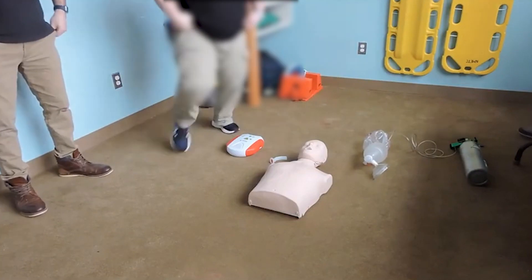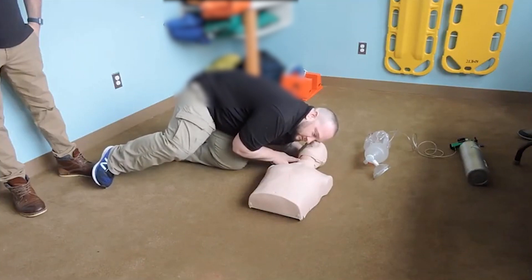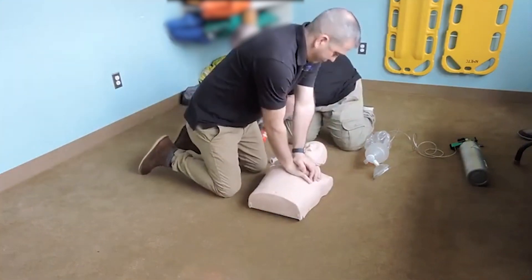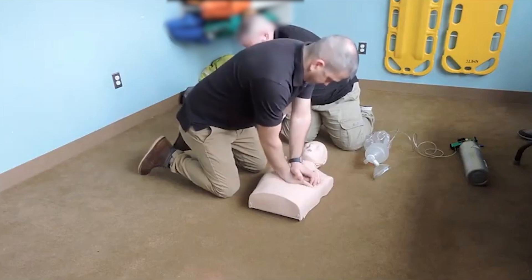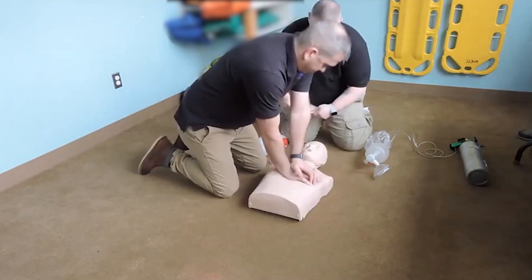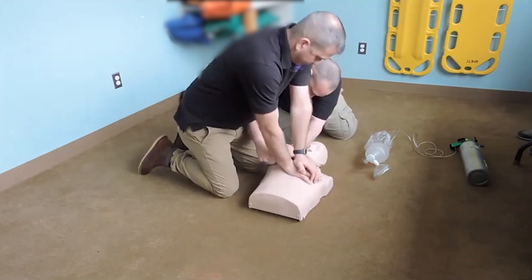On scene. Scene safety, BSI. Finding the patient. Sir, sir, can you hear me? No response. I'm checking for a pulse and I'm checking for breathing. There is no pulse and the patient is not breathing. I'm going to direct my partner to start chest compressions. I'm going to attach my AED, making sure I'm working around my partner.